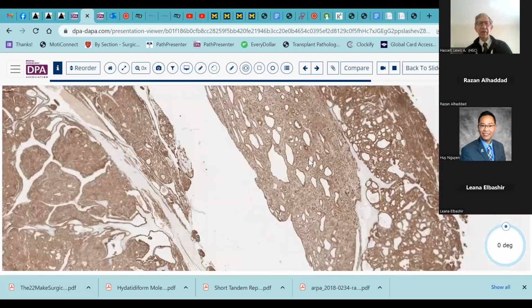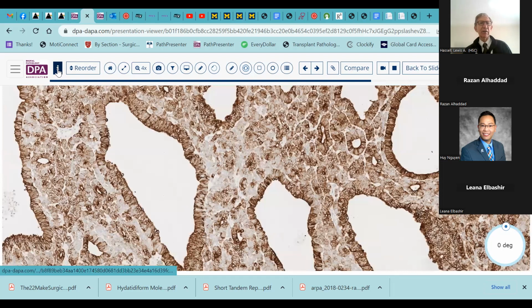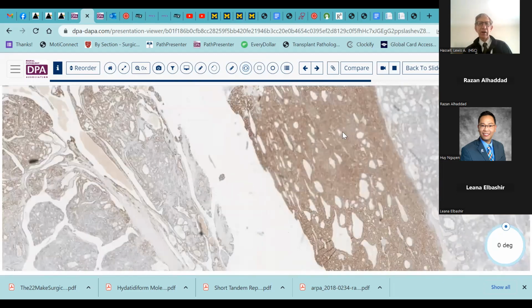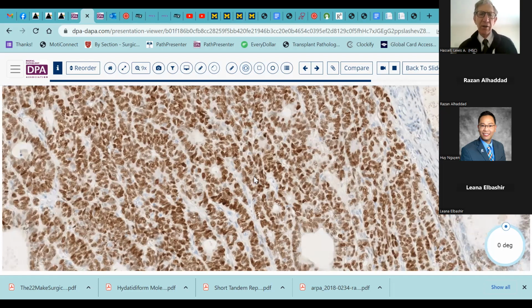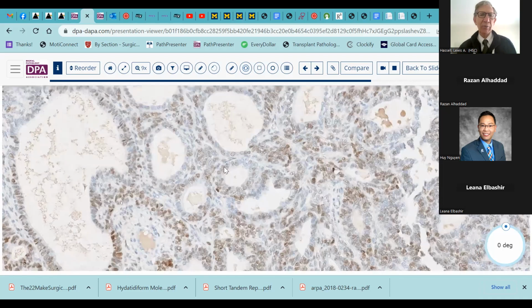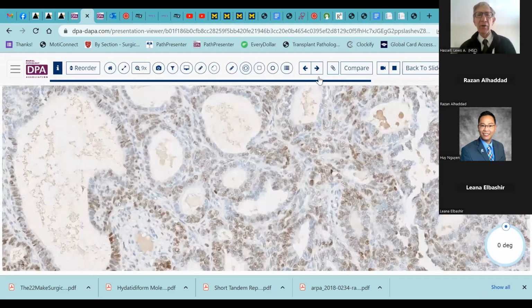Here we have another stain. And as we can see here, this is marking the epithelium, not so much, not as strongly, the more solid part here. I believe this is a CK7. No, pan-CK, okay. So it is a cytokeratin positive tumor. And then here we see an interesting pattern. So we see here, again, this differential expression in different areas of the tumor. Some nuclei staining positive, others less strongly, and actually areas where it looks like the stromal component is almost negative. Check our stain here. This is estrogen receptor. So there's some nice estrogen receptor variability with this tumor.